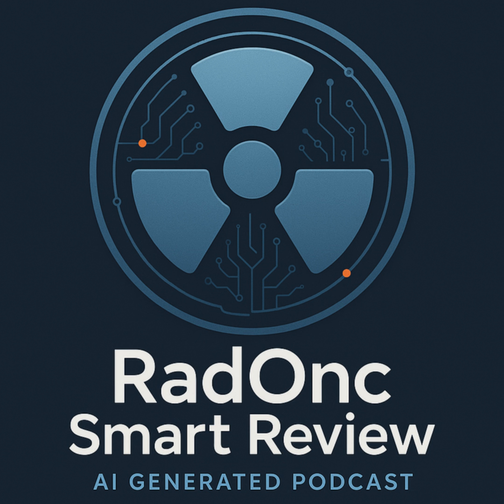Right. With MV photons, higher energy generally means deeper buildup, more skin sparing. More sparing, yeah. But for electrons, it's the complete opposite. The surface dose actually increases as you increase the electron energy. Increases. Why is that? It's a crucial point, and understanding the why is key. So higher energy electrons, they actually scatter less per unit path length than lower energy electrons, especially when going through low density stuff like air.